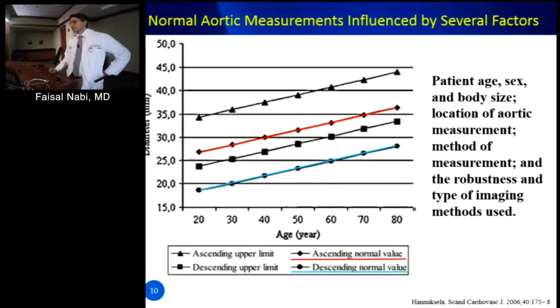In an 80-year-old, I don't think the ascending aorta is 4.5, at least from our own data. These would probably all be, because this is old data, axial measurements. But again, 4.5 is 2 standard deviations above the mean.